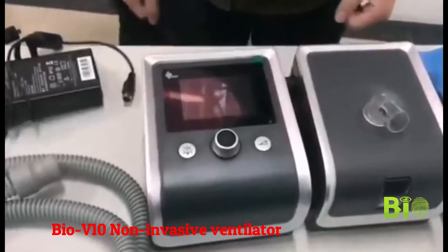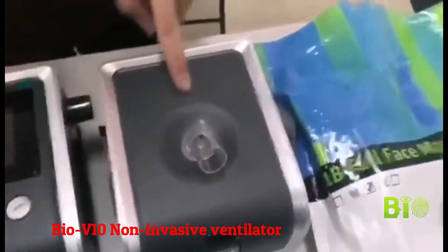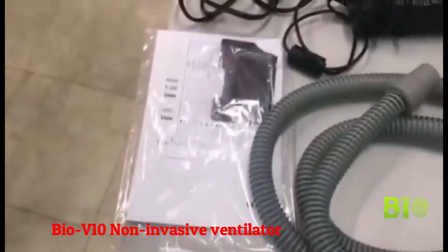As you can see, here is the main device. Here is the humidifier and here is the mask. The tubing, the power adapter, and the user instructions.